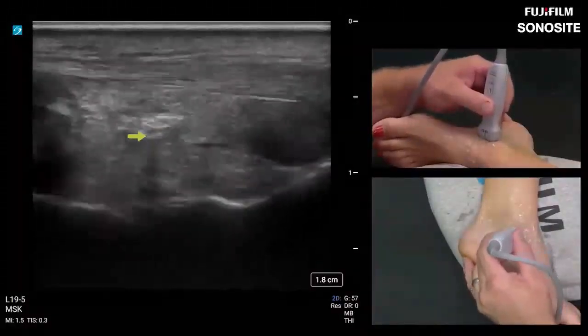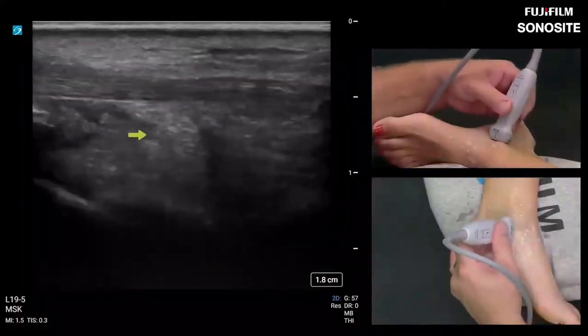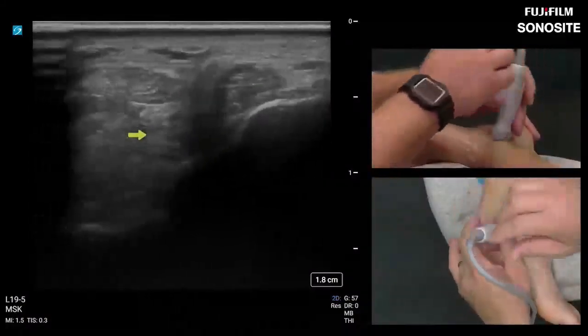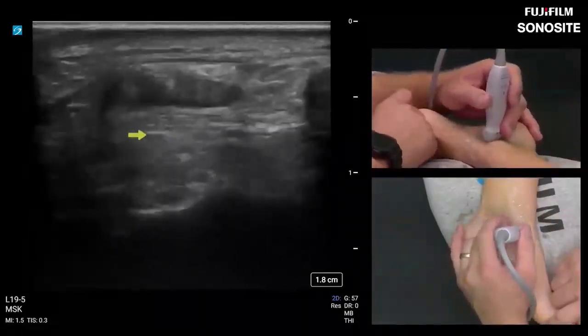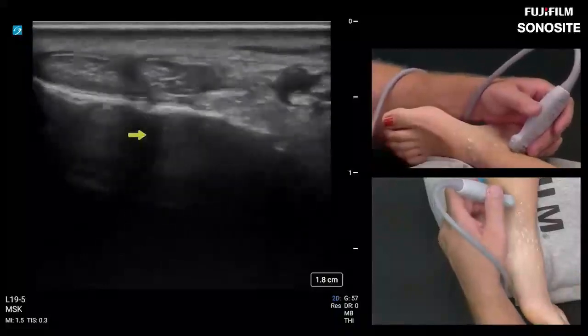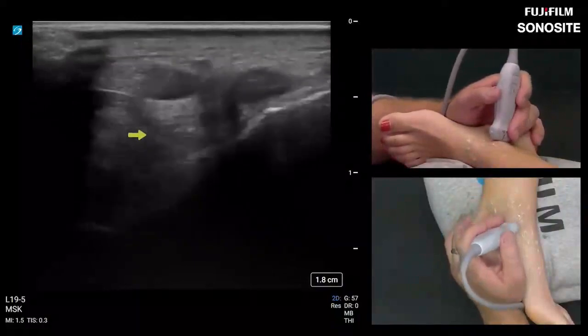All right, so great advantages to using a 19 megahertz transducer, far more detail. The frame rates are actually a little bit more live. So if you're looking at popping, clicking, snapping, this transducer catches those in real time. Very, very nice. And procedurally, it's a lot less transducer in your way when it comes to doing injections around the foot and ankle. So this probe is very nice.